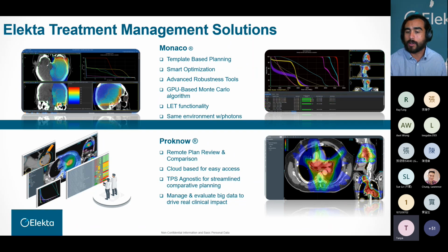It provides TPS agnostic evaluation, so you get streamlined comparative planning workflows. And being able to manage and evaluate big data to drive clinical impact not only makes sure that the patient always gets the most out of the software, but also you're able to manage your staff's retention of education, and you can quickly upskill some of the dosimetrists or physicists in your team so that everyone is capable of using Monaco to the best of their ability.